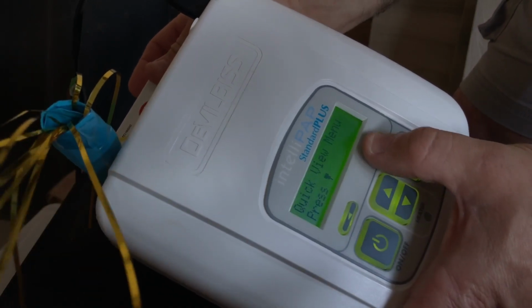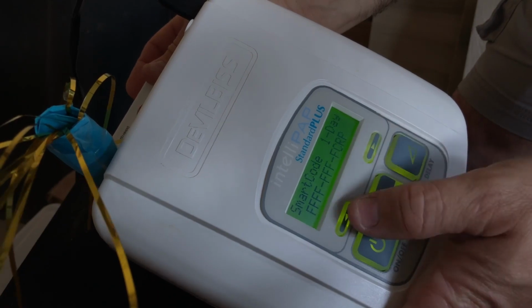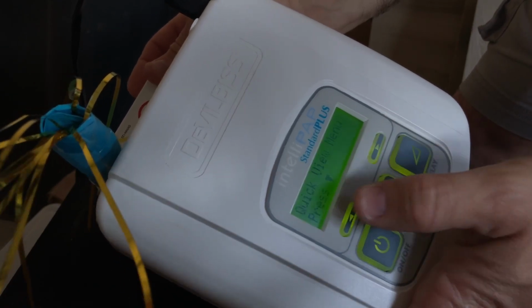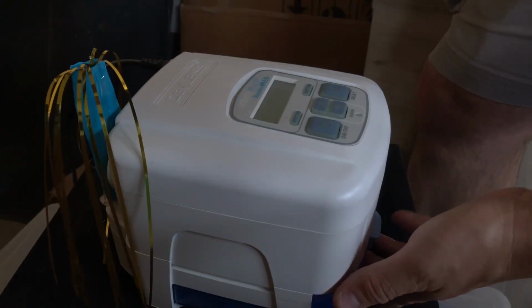Let's see what else we have here. Serial number, adherence score, smart code. All right, anyway, it's an old machine. Let's have a quick look at the back.